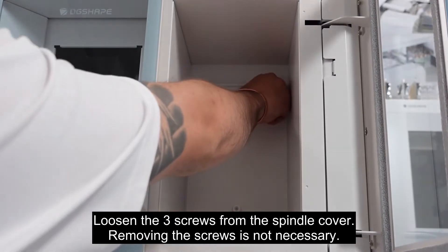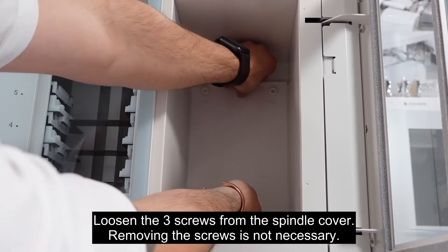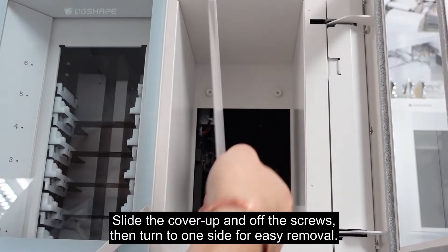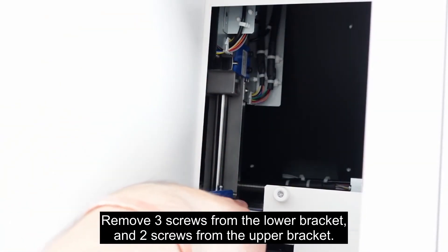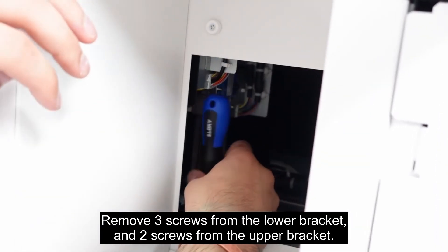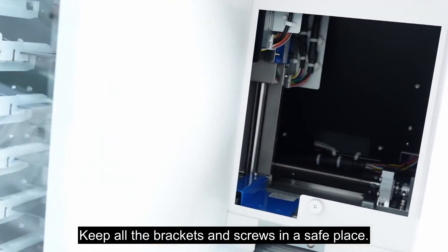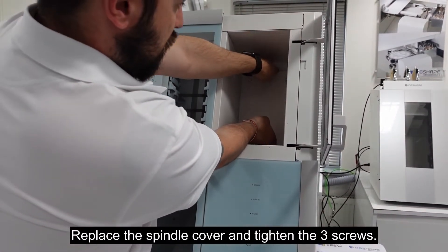Loosen the three screws from the spindle cover — removing the screws is not necessary. Slide the cover up and off the screws, then turn it to one side for easy removal. Remove three screws from the lower bracket and two screws from the upper bracket. Keep all the brackets and screws in a safe place. Replace the spindle cover and tighten the three screws.